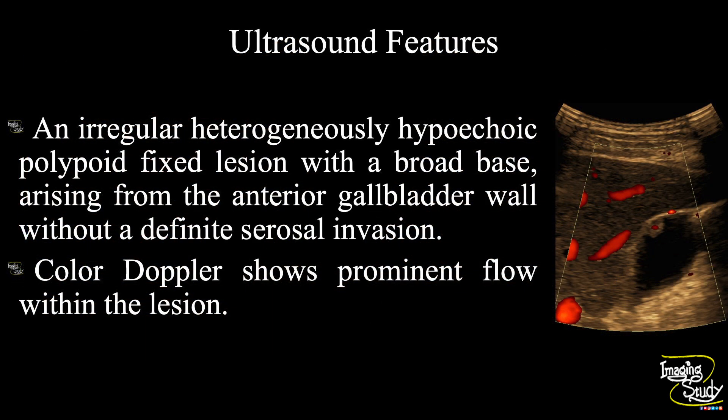In summary, an irregular heterogeneously hypoechoic polypoid fixed lesion arising from the anterior gallbladder wall is noted without any definite serosal invasion. Color Doppler shows prominent flow within this lesion, indicating it as a suspicious polypoid lesion, possibly a neoplastic mass lesion.